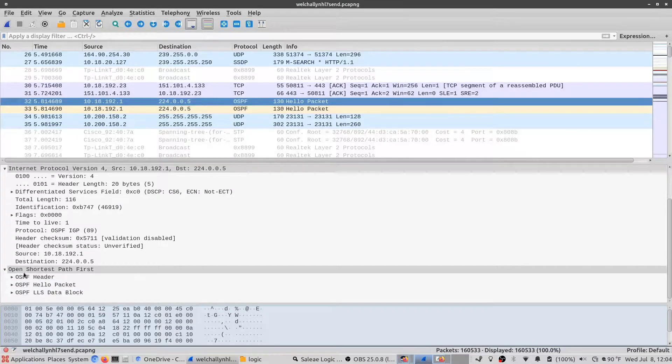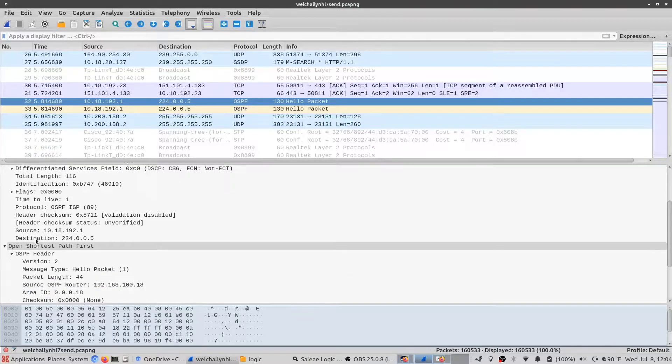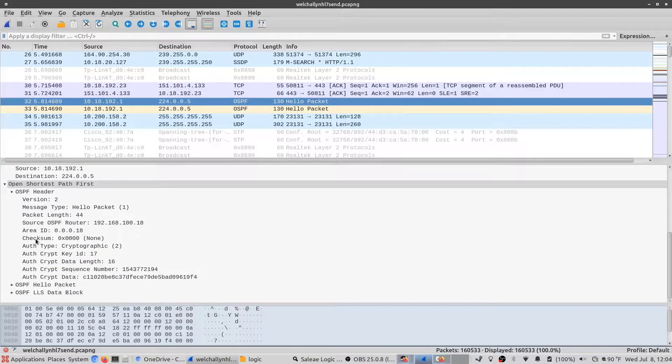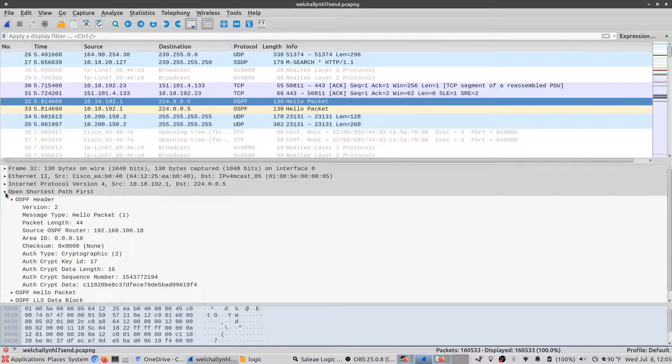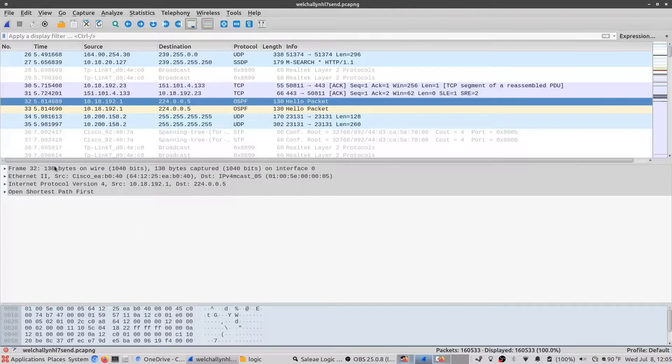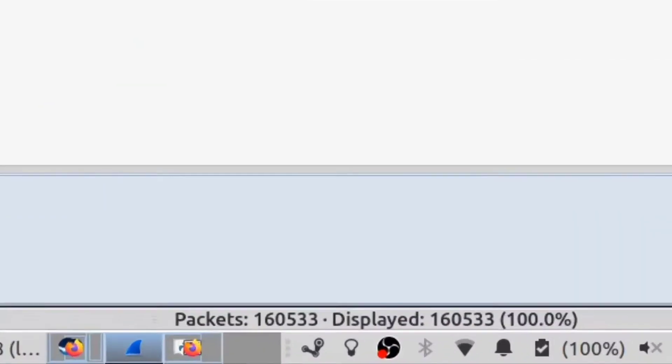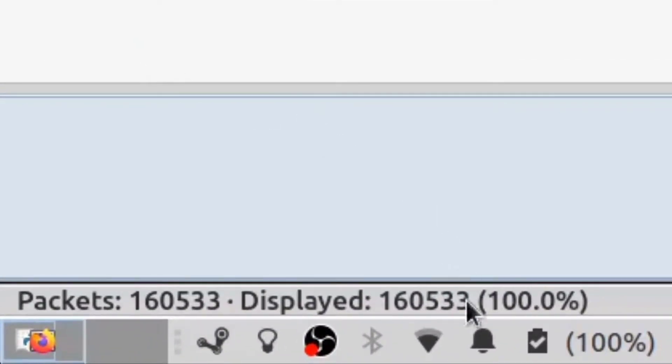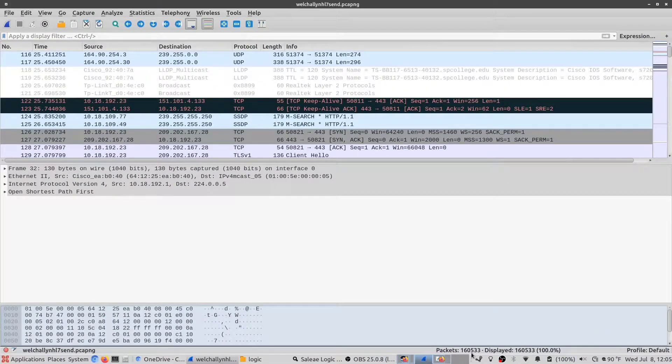So for networking, this program is a very valuable tool in that it lets you really zero in on information that goes through a network. But usually packet captures get pretty large pretty quickly. In fact, you can see this is a pretty large file. It contains over 160,000 individual packets in this one file.